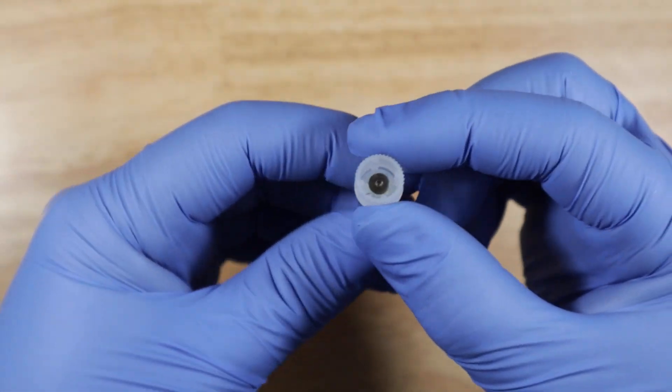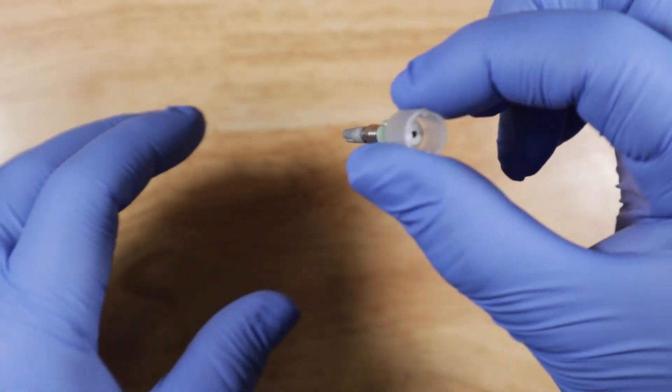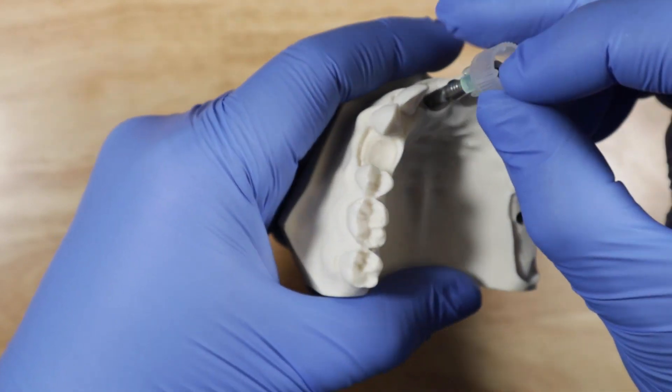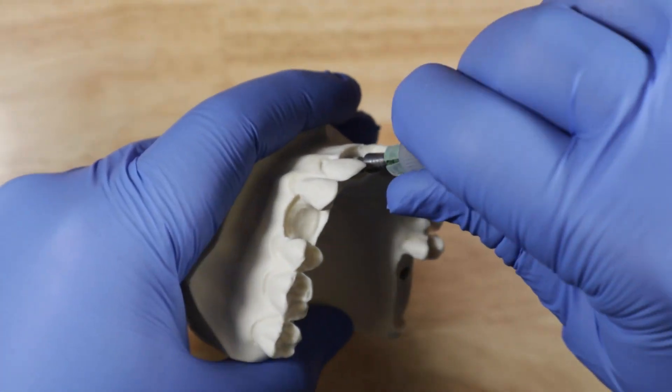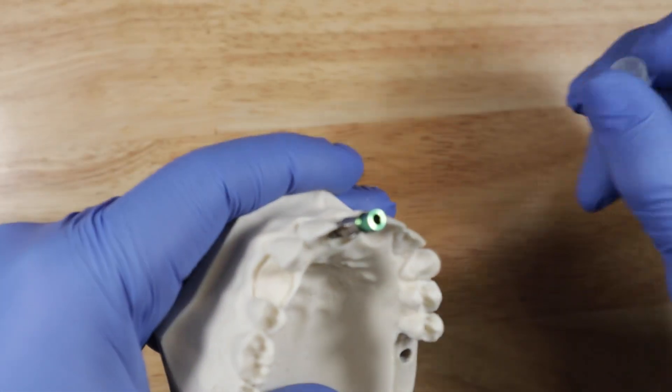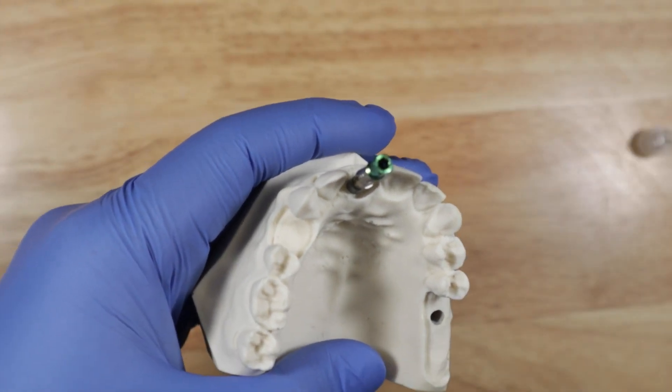So our implants come with this little thumb grip. So out of the little sterile packaging, you pull it out with this thumb grip and after you've already prepped your implant site, you're going to be inserting it with this thumb grip, right? Until basically the torque maxes out and this little thing comes off. It just comes off.